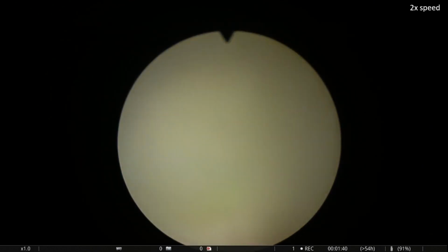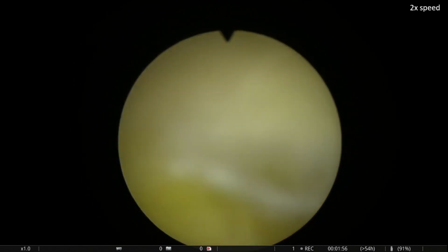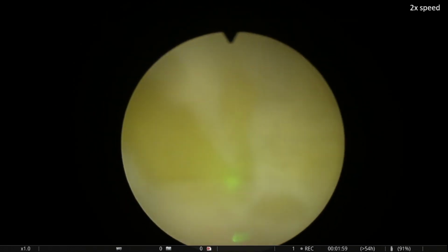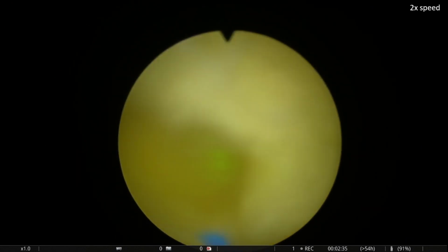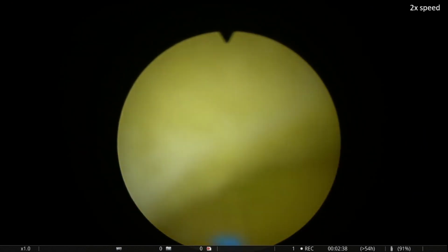A groove is cut into the median lobe just proximal to the verumontanum. The groove is then deepened to the level of the capsule. In this model, the adenoma is yellow and the capsule is white to allow trainees to identify where they should and should not be cutting.